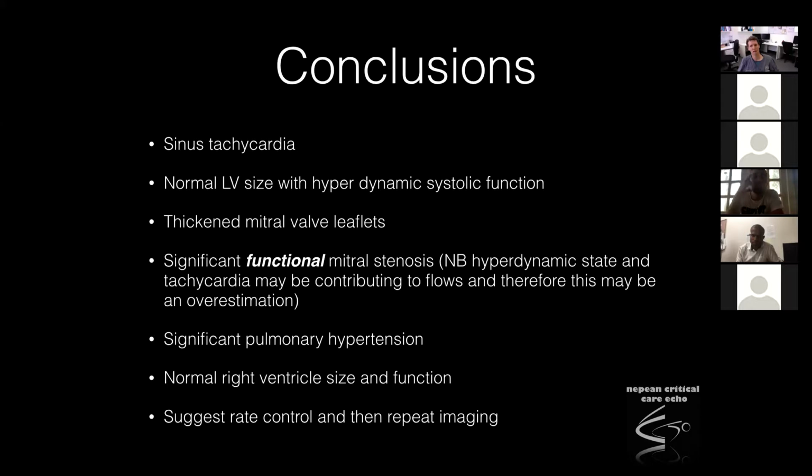Wow. And do you see mean gradients of above 15? Oh, the biggest I've measured would probably be in the 30s. Solid, in sinus. Okay, amazing. Excellent. I've seen a few cases as well where the echoes at the time of the development of pulmonary edema and pulmonary hypertension have looked like severe mitral stenosis.